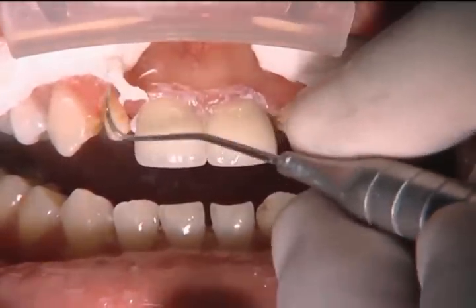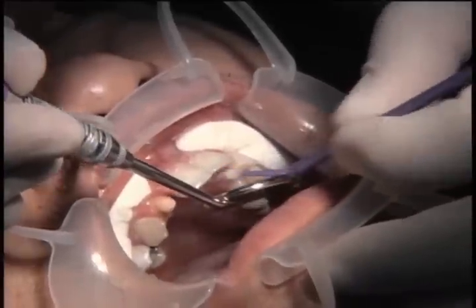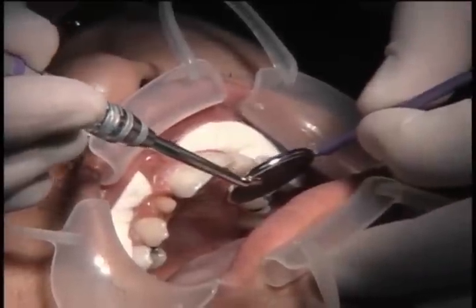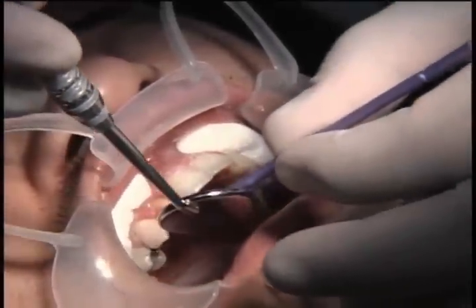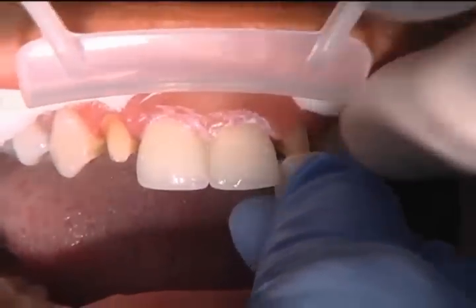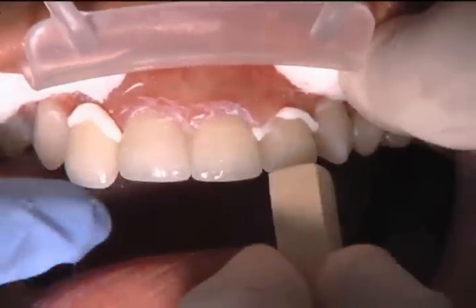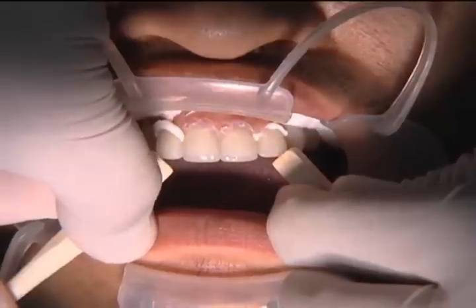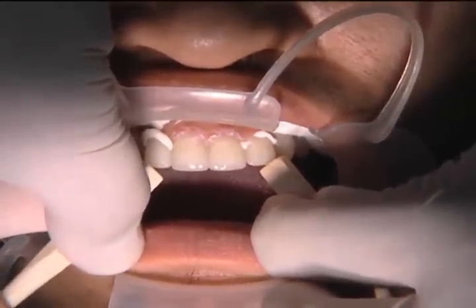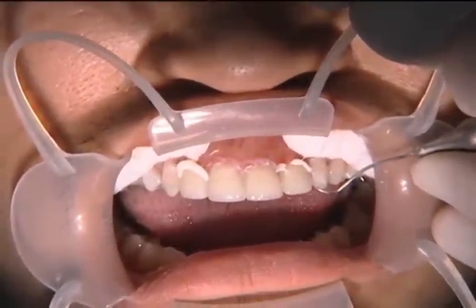We always start with 8 and 9 because if those two teeth aren't in the correct position, we've blown the whole case. We could cement 7, 8, 9, and 10 at the same time, but there can be contact issues. A lot of times if you put in all four and have a contact problem, you're just as likely to get 7 and 10 in the correct position as 8 and 9, and that would ruin the aesthetics. So over the years I've learned to slow down, get 8 and 9 in first, then recheck contacts before cementing 7 and 10.